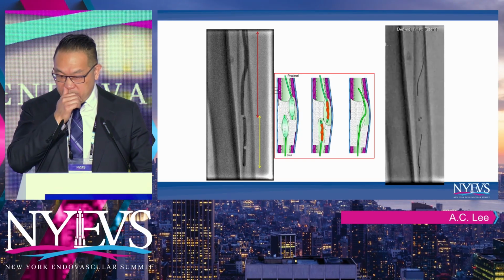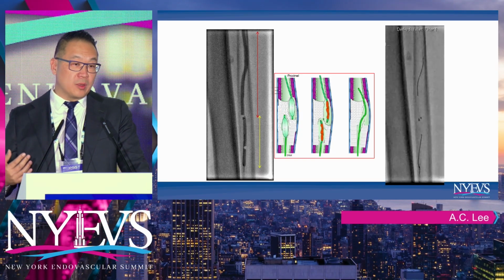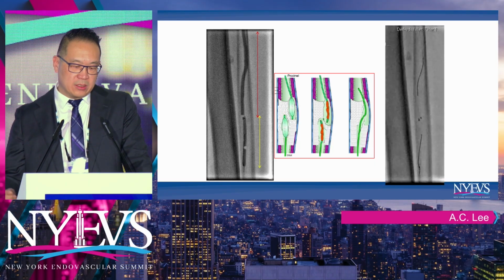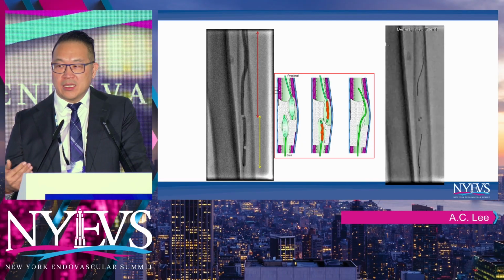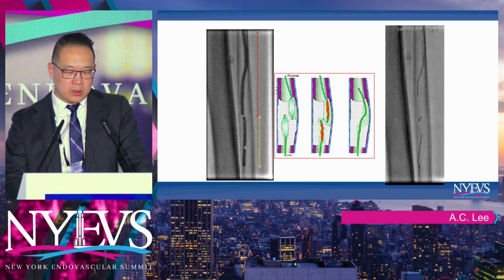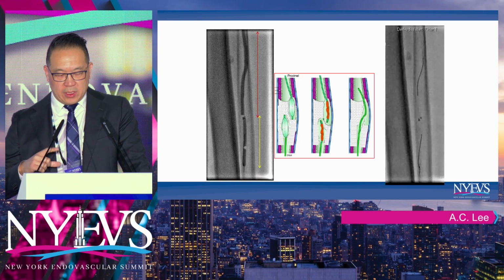When I do double balloon fenestration or single balloon, I always give the advice to right-size the vessel. If you're in a tibial vessel, I like to use 3 millimeter balloons. If you're in a POP, 5, SFA, 5 or 6, okay? I think it works the best. If you take a 3 millimeter balloon and try to do this in an SFA, it doesn't seem to work as well.